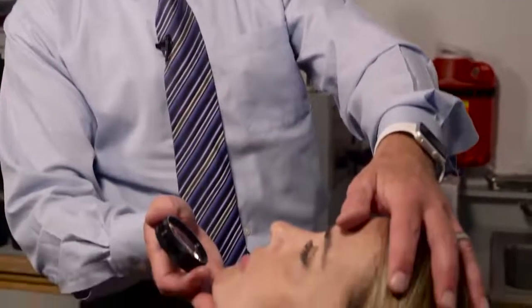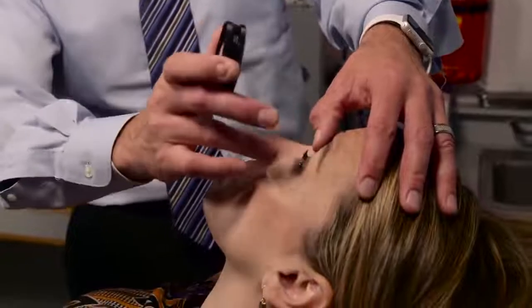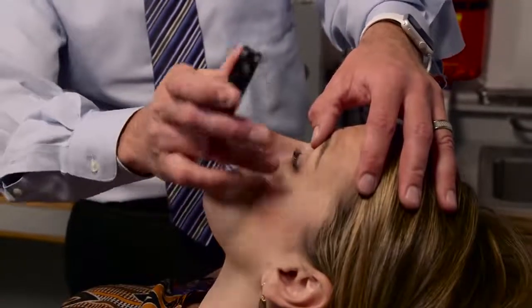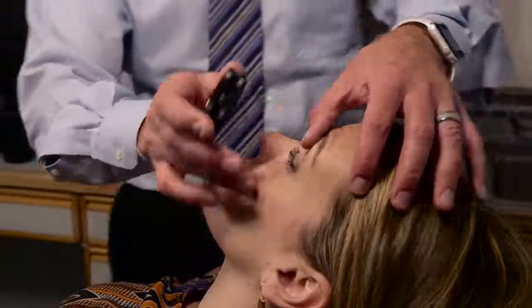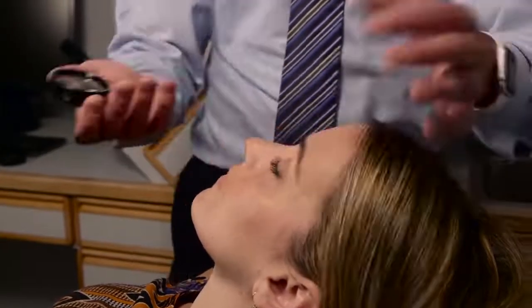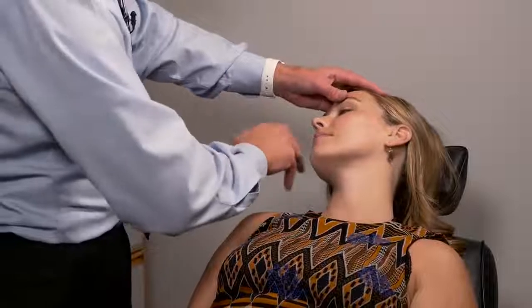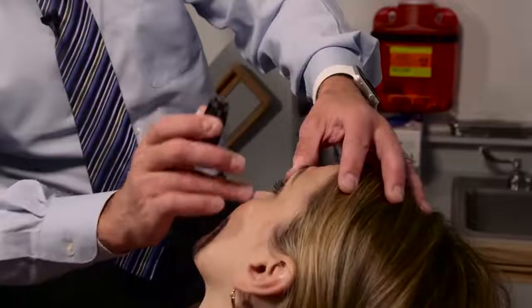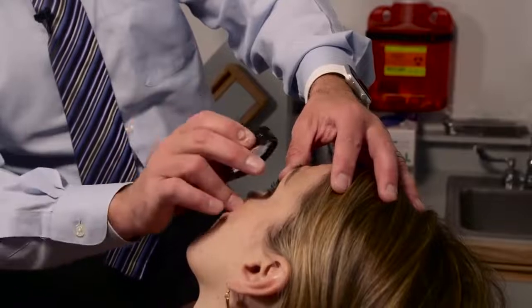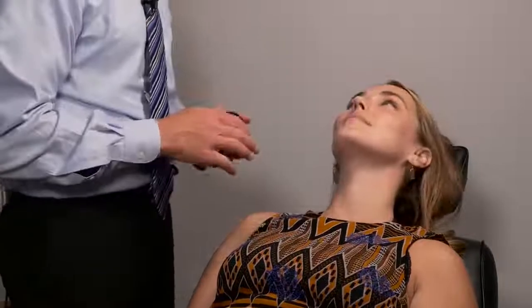So now I do the left eye. So same thing, I'll make sure their head is in the right position. I'll have them look straight up. And then I work temporal, up and to the left, over to the left, down and to the left, straight down at your toes. Very good. Then for this, you could rotate to the other side of the body. It's easier. Or you could turn their head this way, then look down and to the right, over to the right, up and to the right. Very good. And so that's the posterior segment exam.